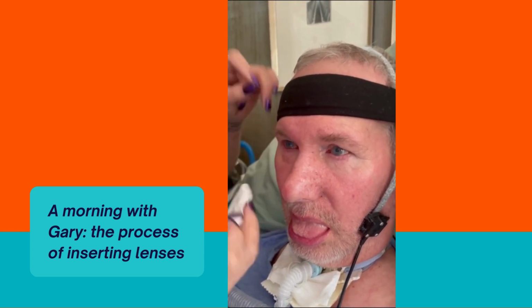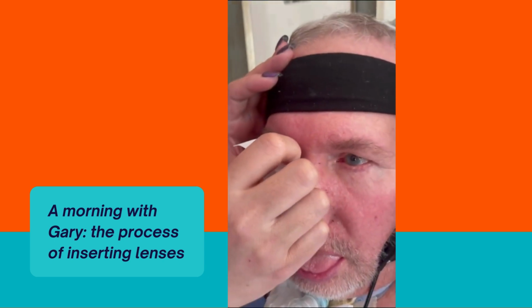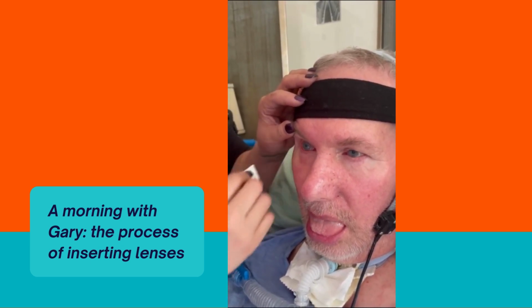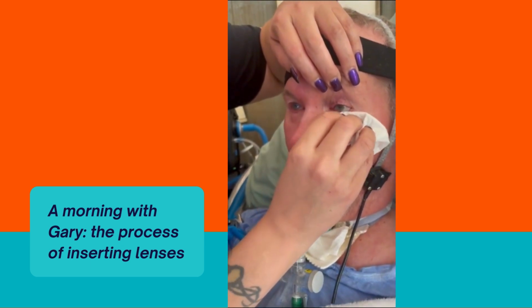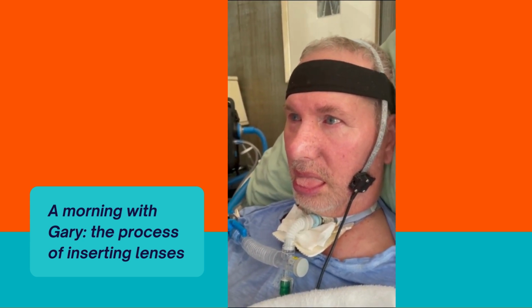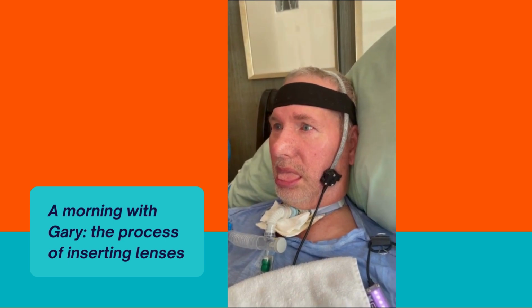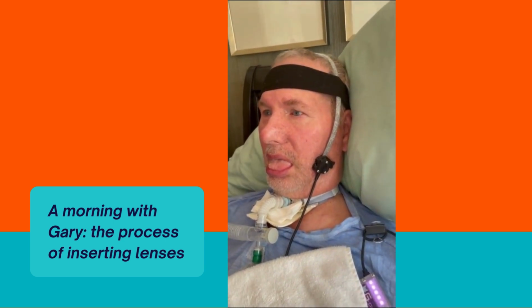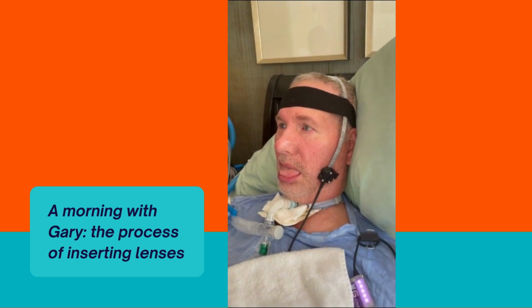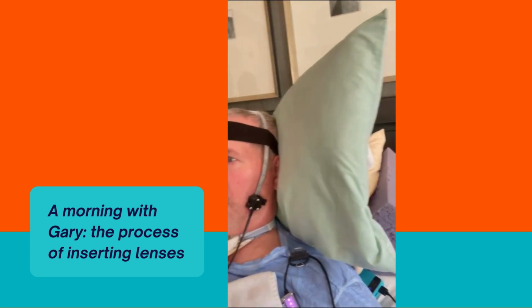For people who don't have ALS and have more ability to control themselves, they always tell people with scleral lenses that you have to lean all the way over and then pop them in your eyeball. We don't have that capability with Gary anyway. He can't lean forward, but you do have to sit up straight, because if they're too far back, all of the liquid comes out and you get a bubble instantaneously. Everything is just going to be starting over a lot.